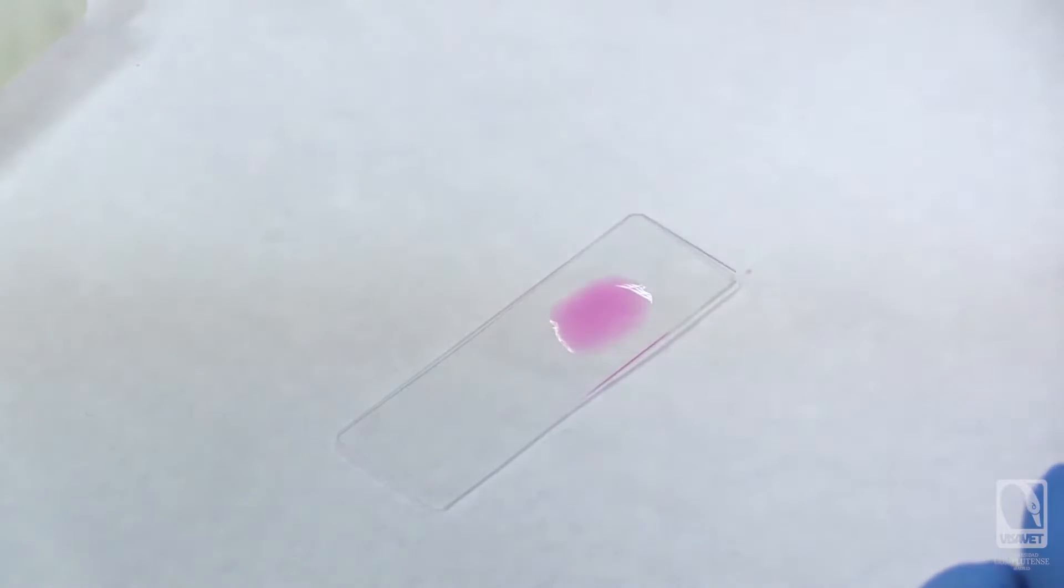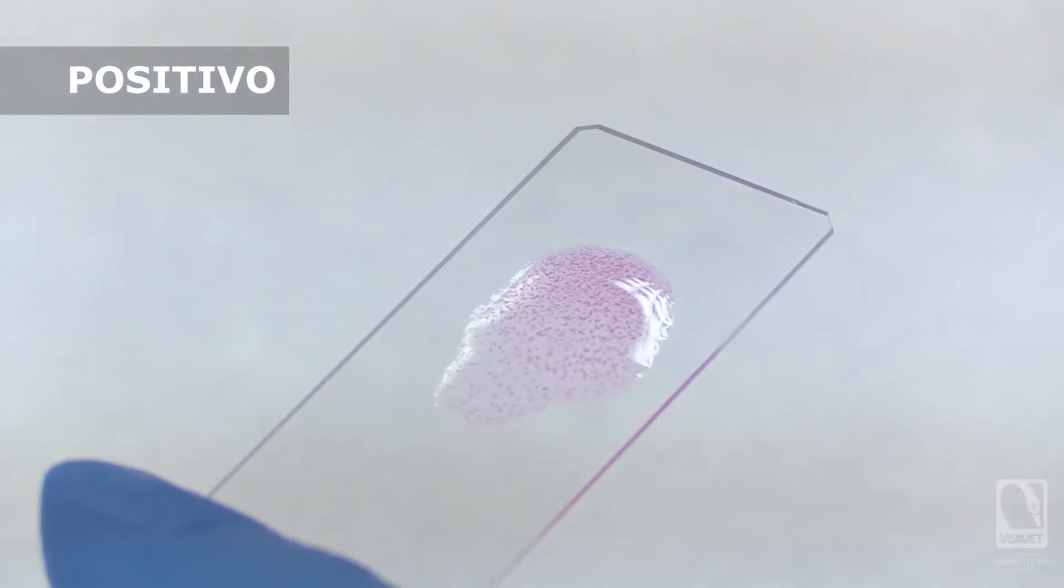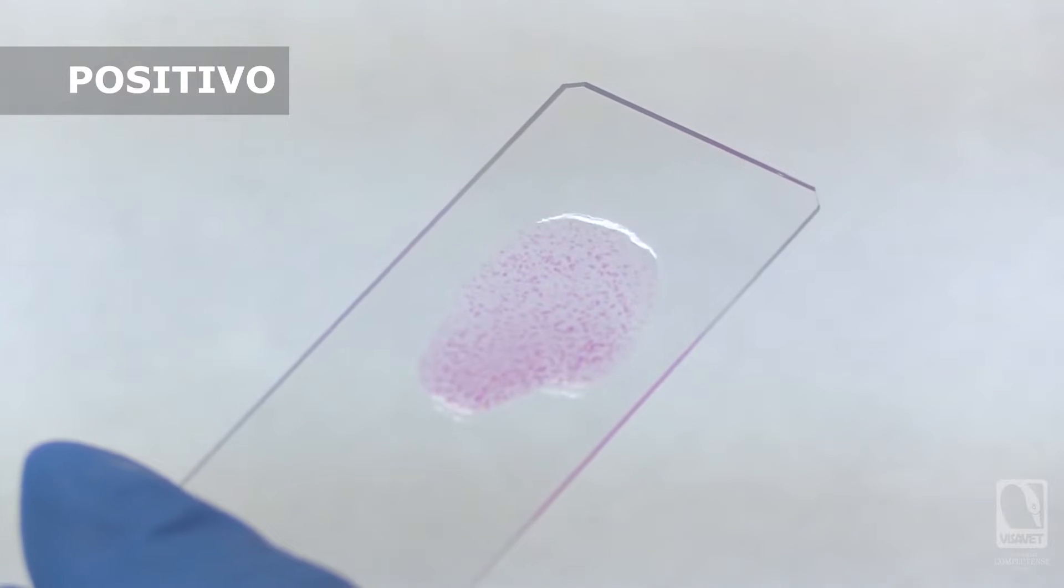Afterward, the slide will be gently rotated for a total of 4 minutes to thoroughly mix the serum and antigen. We will then proceed to observe and analyze the reaction, looking specifically for the visible agglutination.